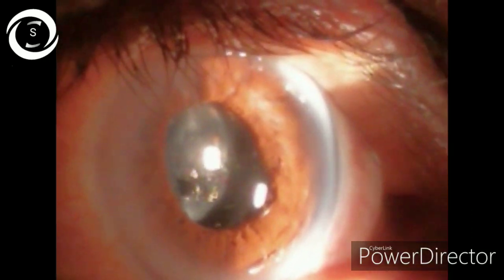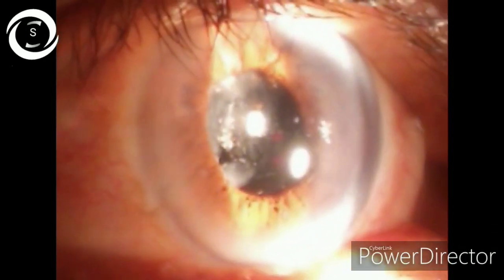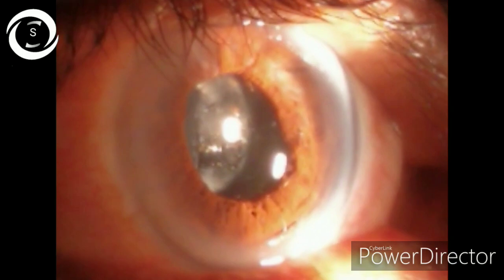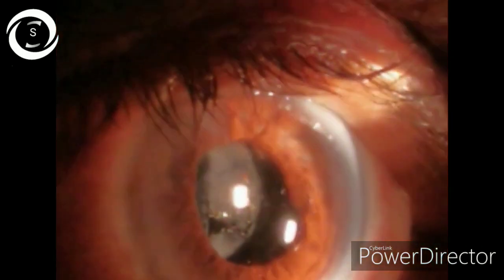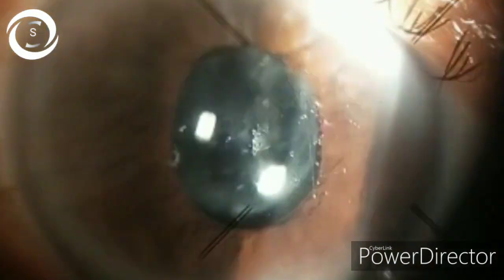On slit lamp, see Elschnig pearls. What are the Elschnig pearls? They are round and clear pearl-like opacities that shine on retro-illumination and Soemmering's rings - these are rings of epithelial cells. Now the question is how to treat the already formed PCO and how to avoid or delay this complication.